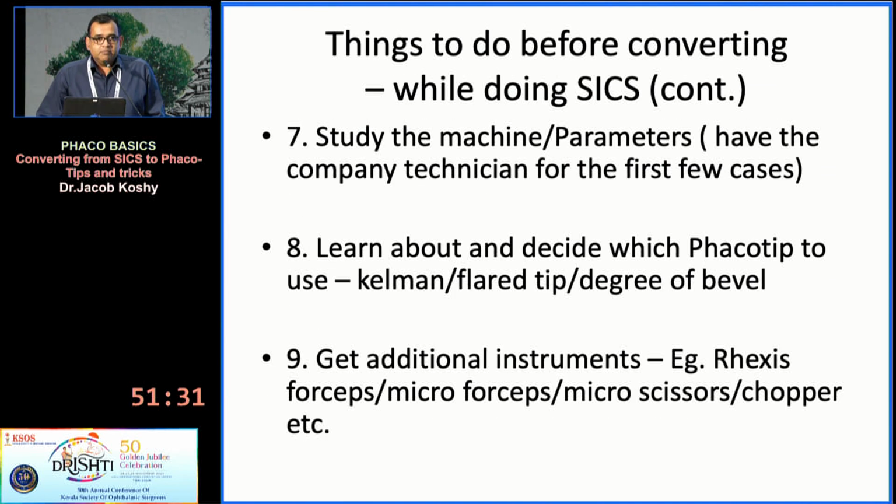Learning about the machine is important. Remember that you have to know about the parameters, what is being used. Preferably have someone from the company. They will help you with your settings in the beginning. You cannot use the settings of a senior surgeon when you start. Learn a bit about the Phaco tip, especially what kind of tip you want to use. It's slightly different, especially some of the Kelman tips, which are angulated quite a bit. You might end up in trouble because you're not used to that. So learn a bit about it and be conscious of that when you're starting surgery.